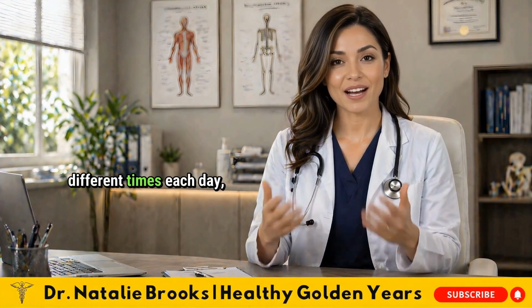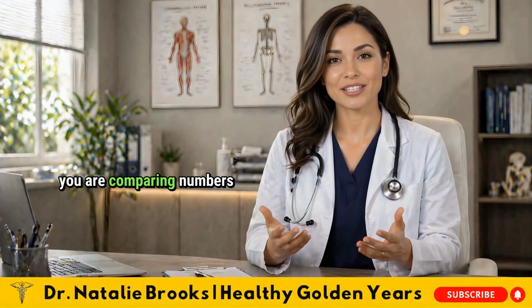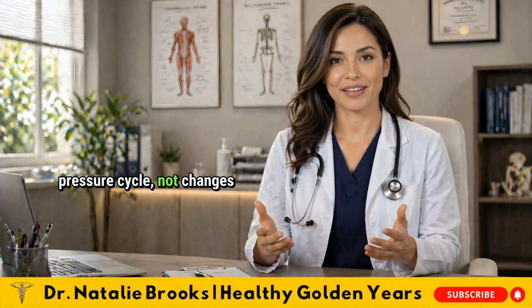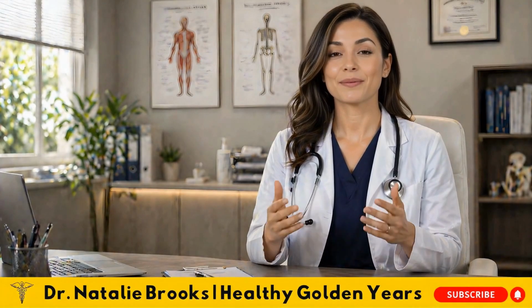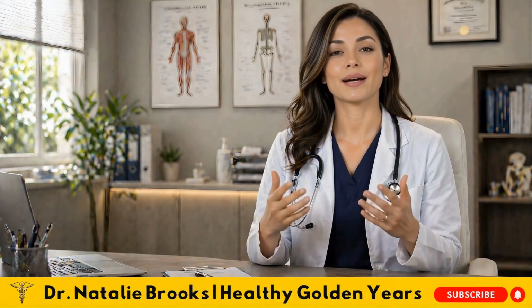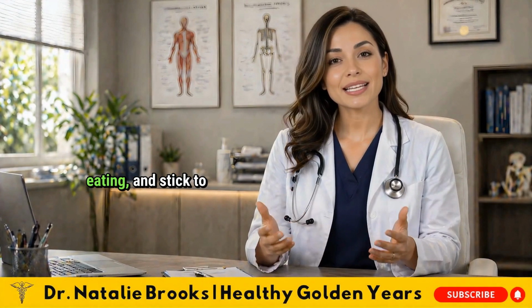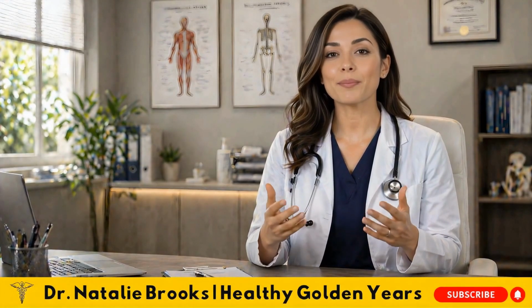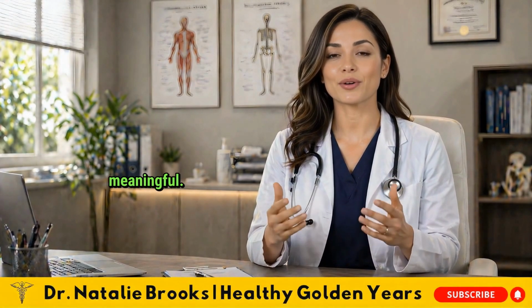If you measure at different times each day, you are comparing numbers that reflect different points in your daily blood pressure cycle, not changes in your underlying condition. Choose a consistent time, ideally in the morning, before medication and before eating, and stick to that same time every day. This consistency is what makes home monitoring clinically meaningful.